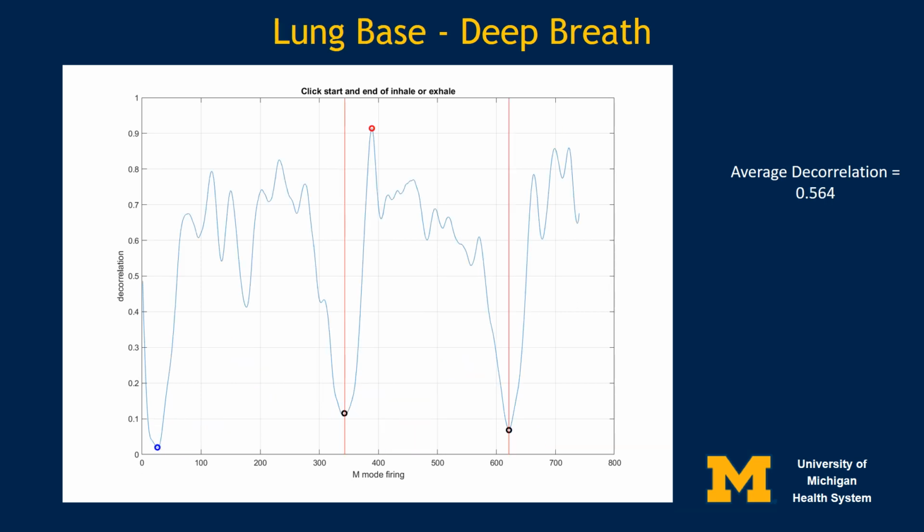And then when you go to the base, the lung motion increases a lot. The decorrelation is much greater, and so the extent of the motion is greater. You'll notice that the decorrelation between the breaths may not relax to zero. That's just an arbitrary standoff, so the measurements are made taking that into account.